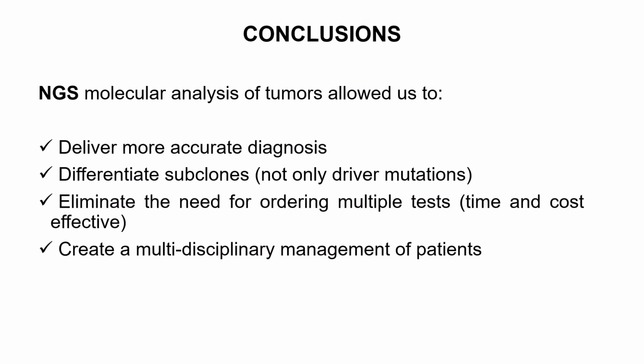Then it helps us differentiate subclones, not only driver mutations. In fact, NGS allows for the detection of both driver mutation and subclonal mutation within tumors. This capability is crucial for understanding tumor heterogeneity and evolution, which can influence treatment decision and patient outcomes.